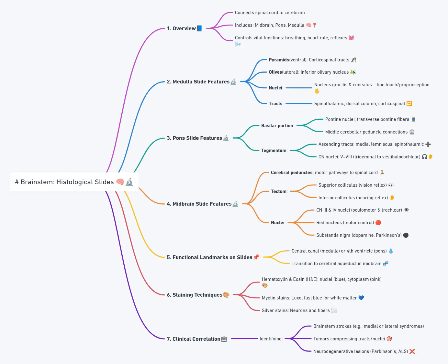Slide 6, Caudal midbrain, tectal region. The aqueduct is central. Dorsal to it are inferior colliculi. Their underlying nuclei appear as paired rounded masses. Medial periaqueductal gray surrounds the lumen. Medial lemniscus and spinothalamic tracts occupy anterolateral tegmentum.